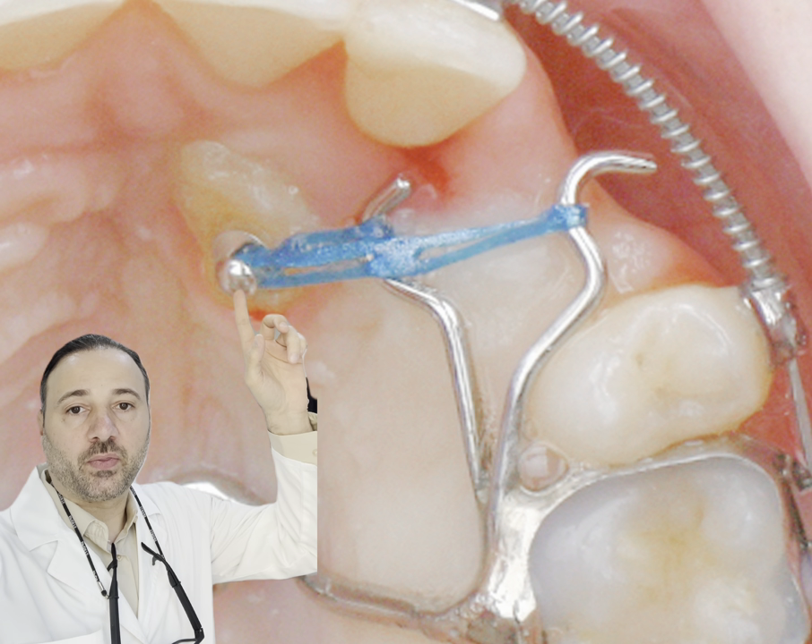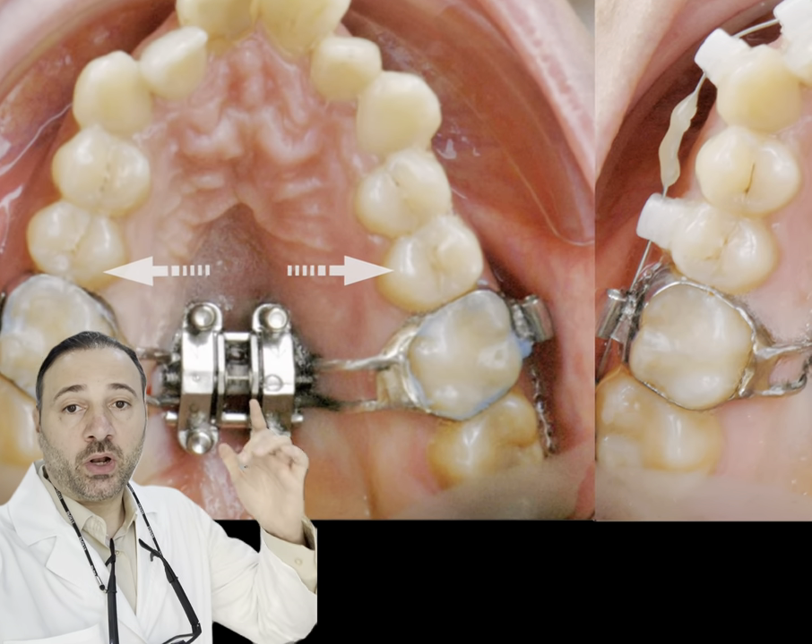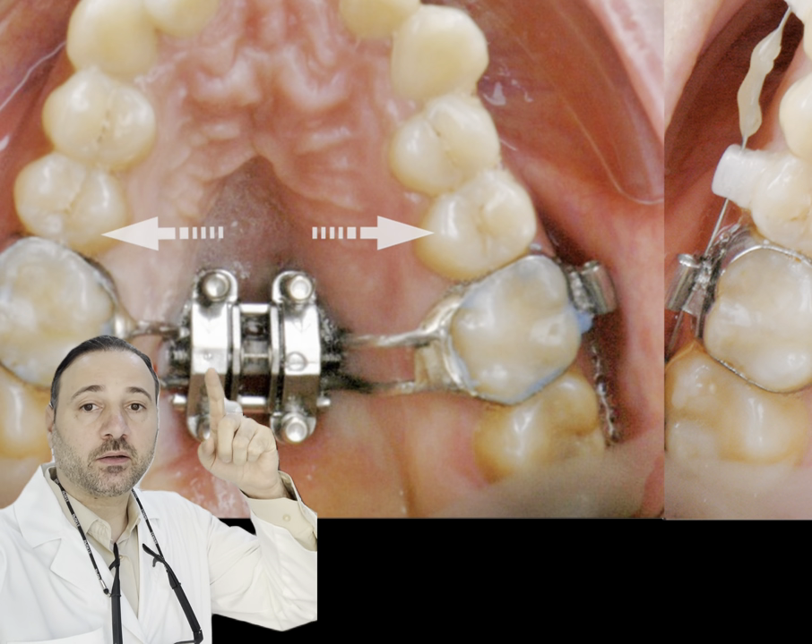The two palatal TADs connected with the TPA were used to bring that impacted canine to the normal or correct position. Also, the well-known expander — the MSE — uses four palatal TADs.